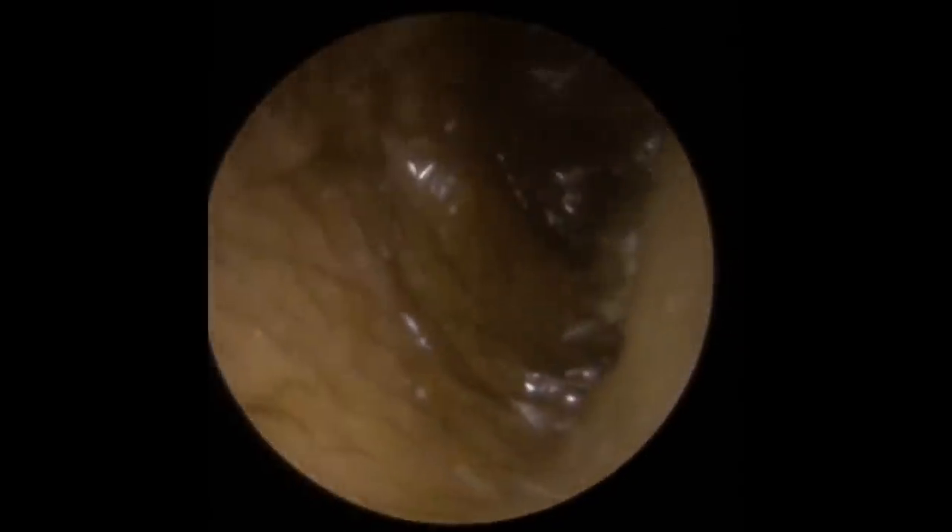This is the second patient now in the compilation. This gentleman has come through with reduced hearing, mainly on one side — not so much with an issue on the other side, just a little tiny bit of irritation on that ear. You can see the wax is a little bit deeper in than the last patient, but still looking quite soft. So we're going to use the standard size Zollner tube here, just to peel around the edges — you can see it just lifting there.